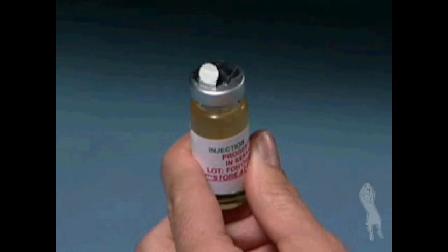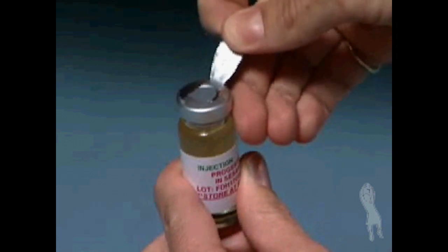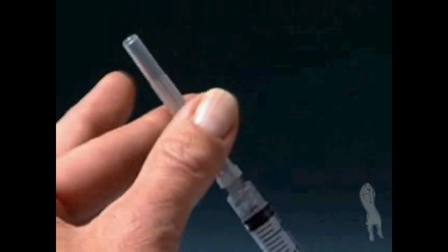Using your thumb, hold the protective plastic cap off of the vial. Wipe the top of the vial with an alcohol swab for each injection of progesterone.